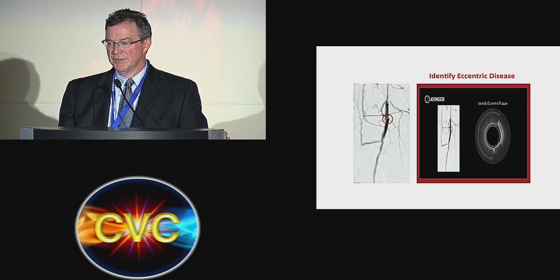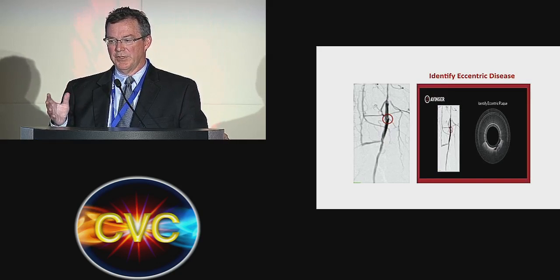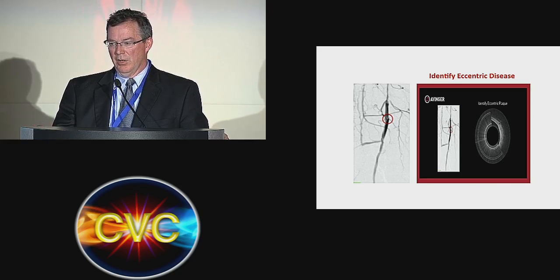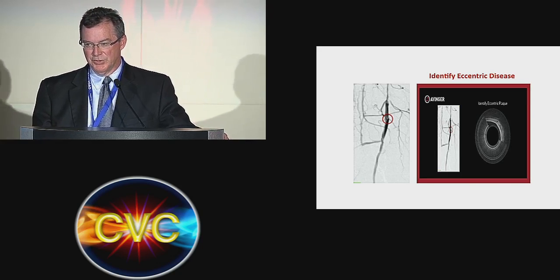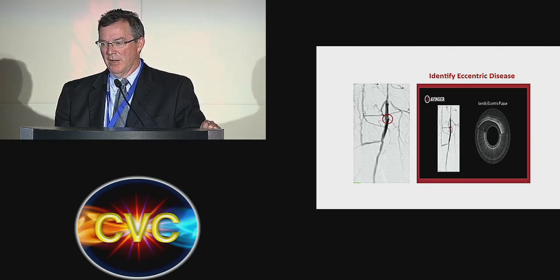This is the case. As you can see on the right-hand side, they're scanning this, and the cutter is actually closed. So you can move this up and down, rotate around, and look where the disease is. You don't really see any layered structures till you get here, and so you can point the catheter in the opposite direction and see. If you look at this, this is a post-atherectomy device case. Now we have the cutter opened up, and you're rotating it around.